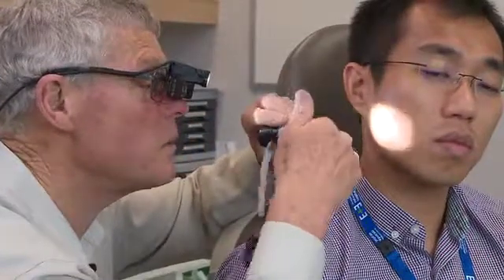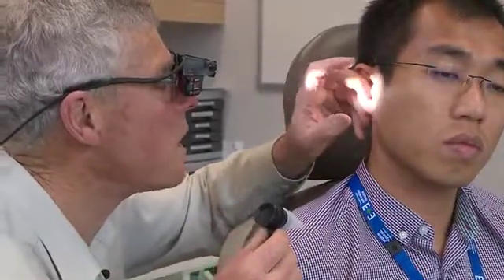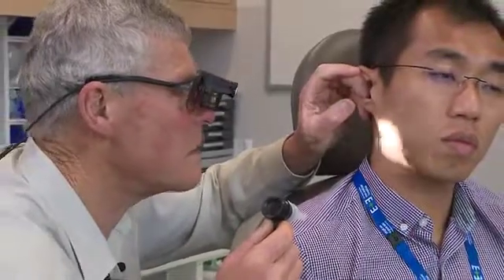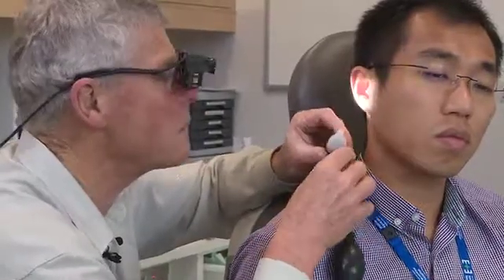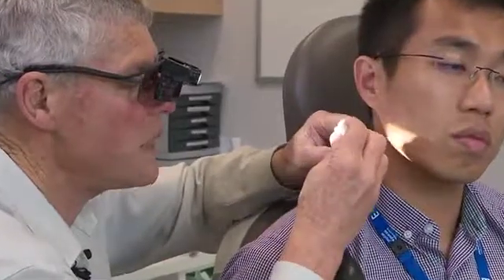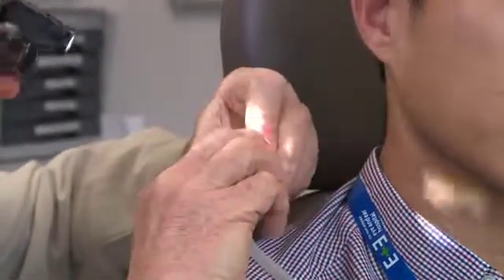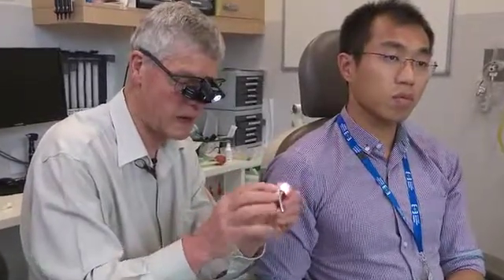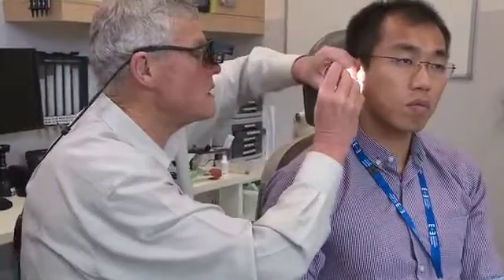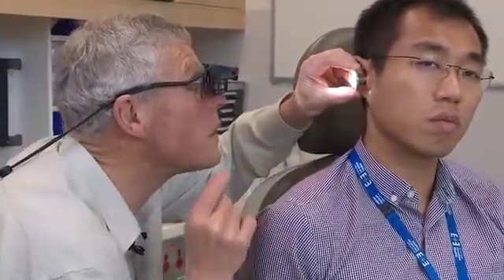And if it's not airtight enough, you can wrap a little bit of blue tack around the end. Now this is a skill that might take you 20 or 30 attempts to develop, but in a medical career that's not much at all, and the payoff is very considerable. Speculum size — it should always be the biggest one that can fit. The shape should be oval, and if it's a difficult shape and you want to make it airtight, you use a bit of blue tack. The other speculums people would have seen are these ones, called Farrier pattern — they're designed for operating. They've often got a beveled end, but they're not actually as easy to use in clinic. The biggest reason they're not the standard is because they're not geared up to plug into one of these.